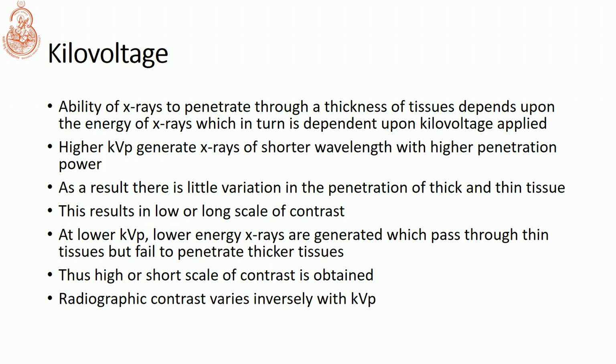Kilovoltage: it is the ability of the X-rays to penetrate through a thickness of tissues, which depends upon the energy of the X-rays, which in turn is dependent upon the kilovoltage applied. The higher kilovoltage produces high energy X-ray photons, which have shorter wavelength and higher penetrability. As a result, there is little variation in the penetration of thick and thin tissues.